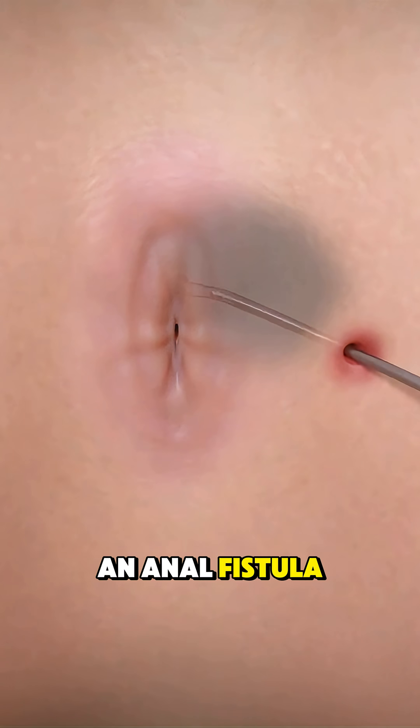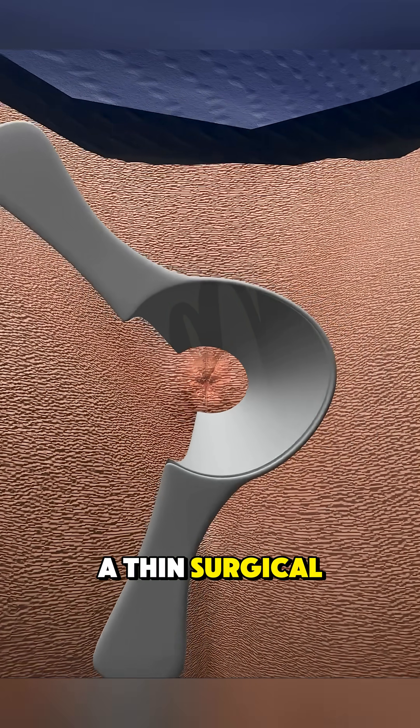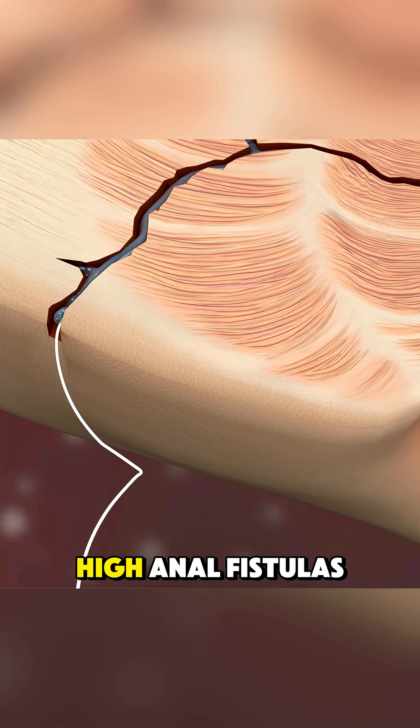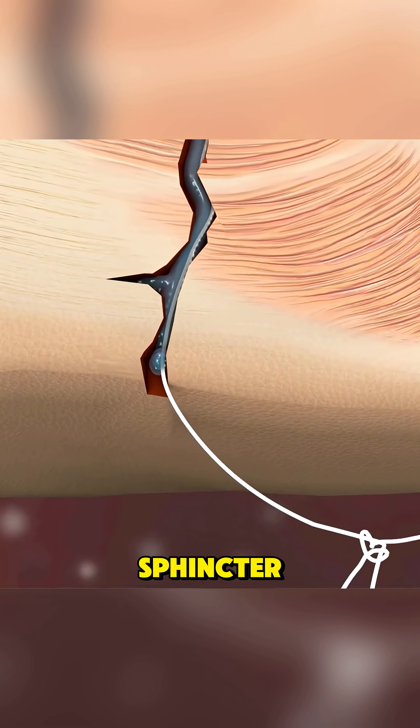Ever wondered how an anal fistula is treated using a seton? A seton is a thin surgical thread or rubber band used to help treat complex or high anal fistulas that pass through important muscles like the anal sphincter.